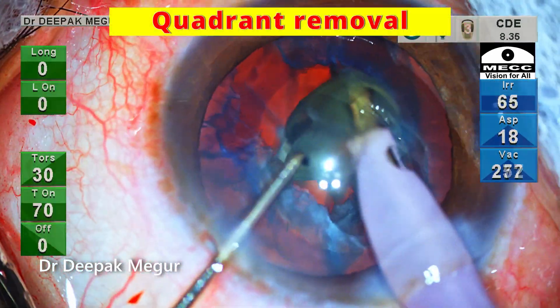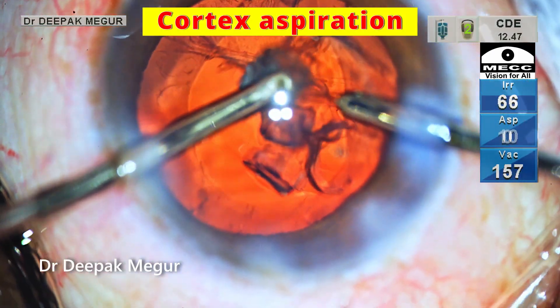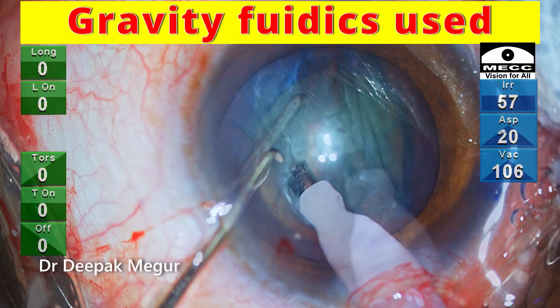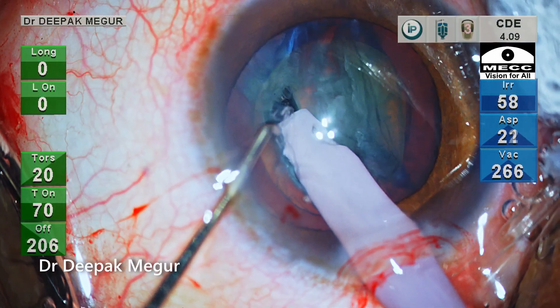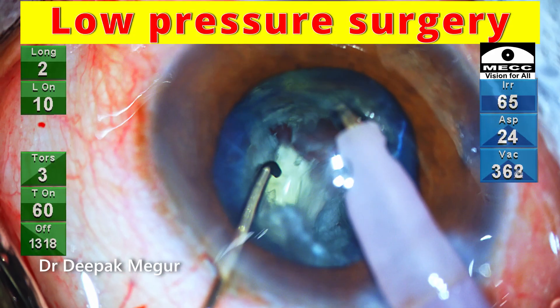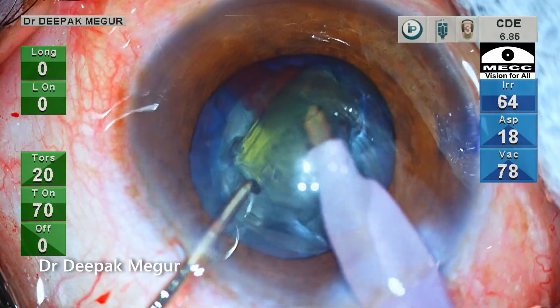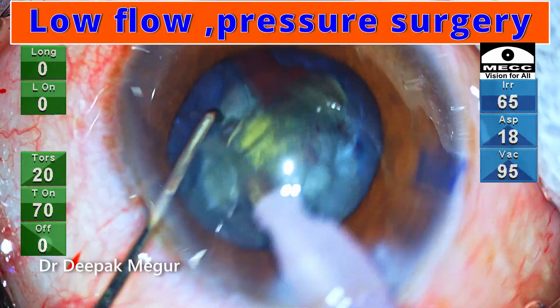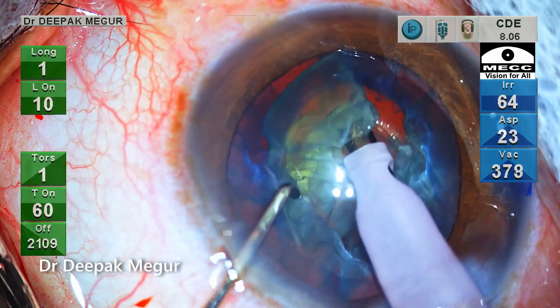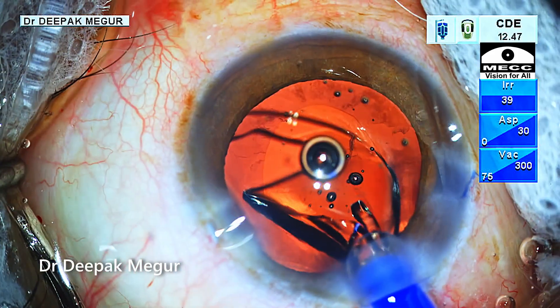Trenching, chopping, quadrant and epinucleus removal were all performed under low bottle height, including cortex aspiration. The Centurion phaco machine with gravity fluidics was used in this case — not active fluidics. Just highlighting the fact that active fluidics is not always essential to perform this low pressure surgery; reducing the bottle height will work quite well. I found this principle of low flow, low pressure surgery quite beneficial in eyes with posterior polar cataracts, and it does have an impact in reducing the incidence of posterior capsule tears in these vulnerable eyes.